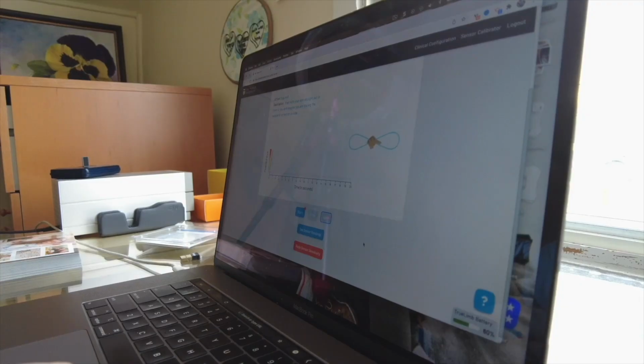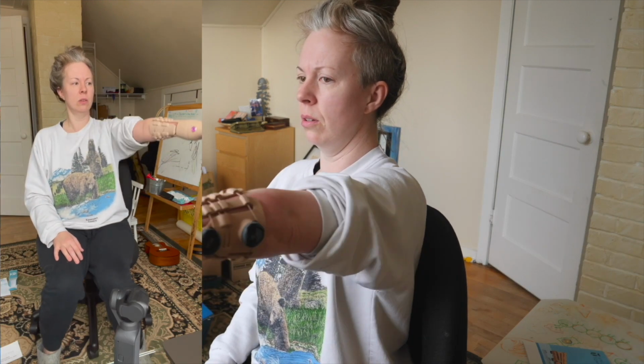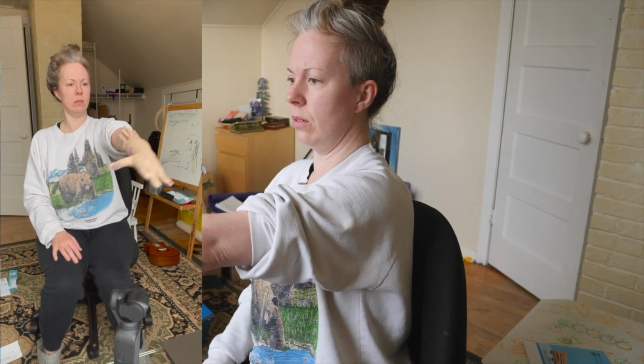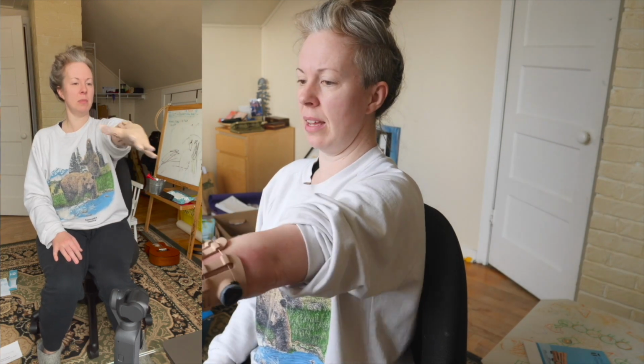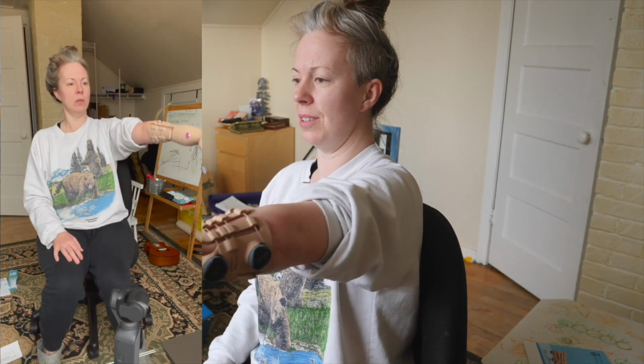Start with your arms straight out in front of you and imagine you are tracing the number 8 on its side, okay? I'm tracing my 8 in front of me. Whoa, whoa. This is so cool. This task will start in 5 minutes.